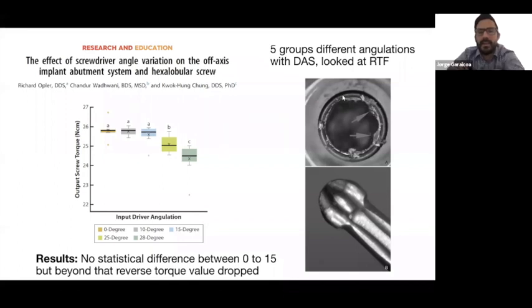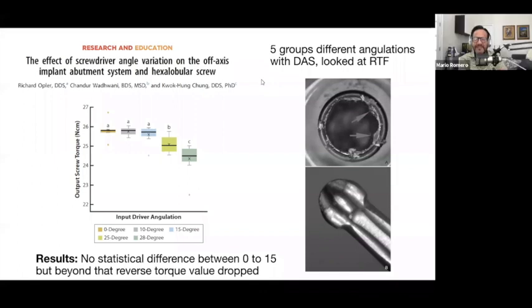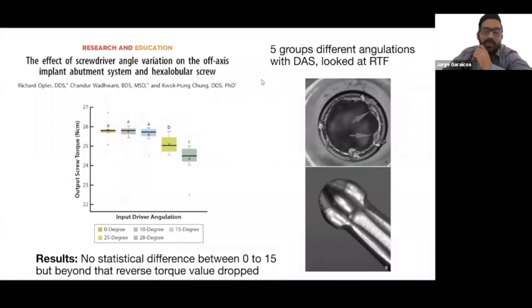Exactly, exactly. So that option of being retrievable can be eliminated when we have a problem like this, because you will not be able to retrieve it anymore unless you cut the screw out. You're right. It may be a very difficult situation. And this screw is angled. How are you going to get it? You need to remember that when you cut that screw, you're using a straight burr. How are you going to get it? It's going to be really hard to do. I haven't had the chance to cut those angled screws yet, but hopefully that's not going to happen.